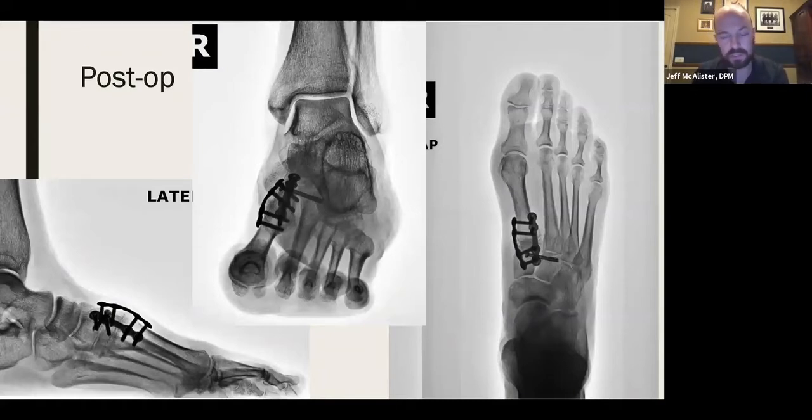And still these patients, I mean, she actually came in a tennis shoe at like 3 weeks. I said, please do me a favor, please at least get into this post-op shoe or something. She was doing phenomenal. I don't know whether it was the Nanobone or whether it was her just being a crazy athlete, but something had to meet in the middle. So she was able to get realigned well. We filled any voids. If there is any plantar gapping or whatever you run into, you can always fill those voids with some sticky Nanobone, and you don't have to worry about it running away from you, as Dr. Yeager said. So another success story, and she is doing well.